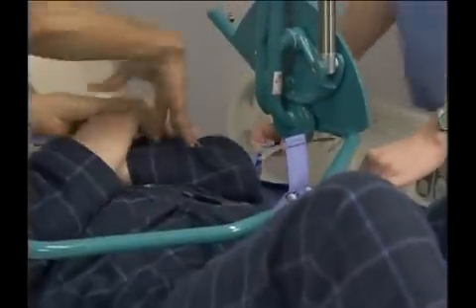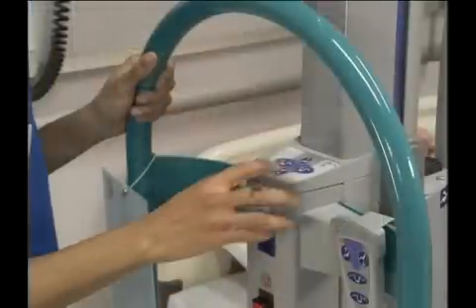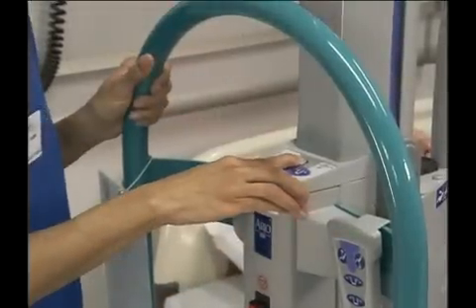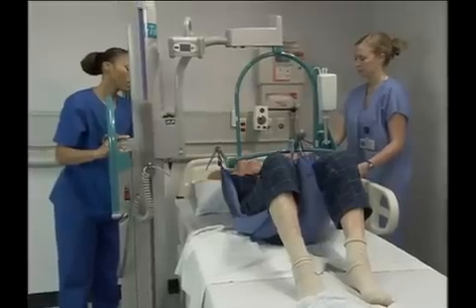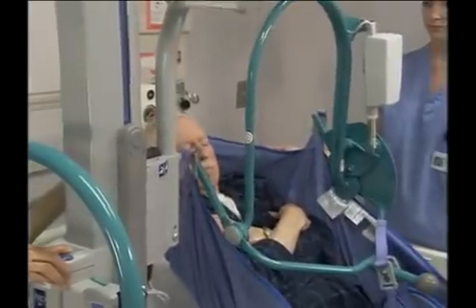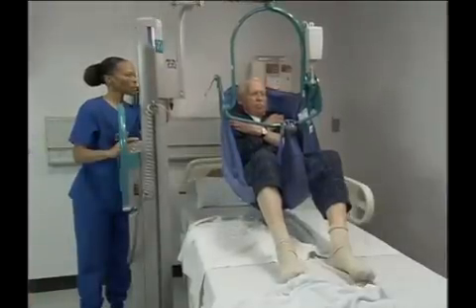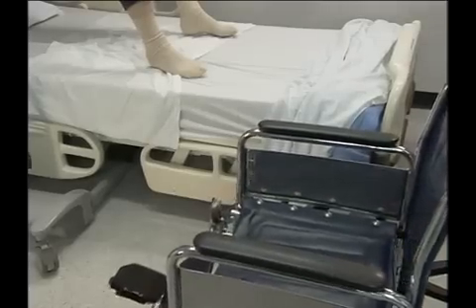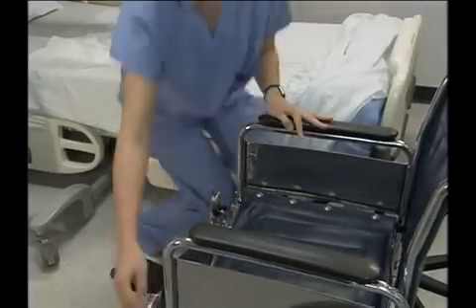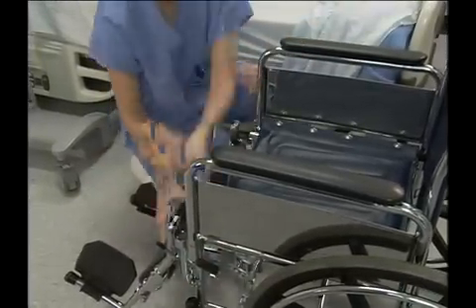Cross the person's arms across his chest. Raise the lift until the person and the sling are clear of the bed. Then raise the person. Place the wheelchair alongside the bed, facing the head of the bed. Lock its wheels and position the footrests and armrests out of the way.